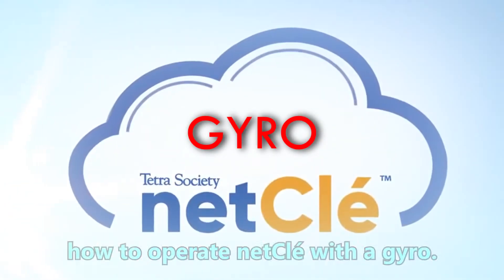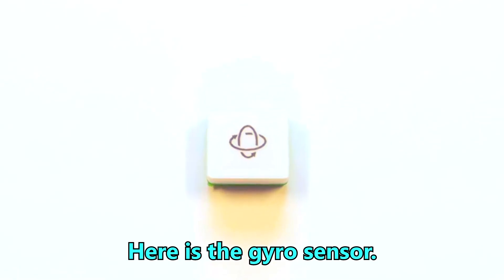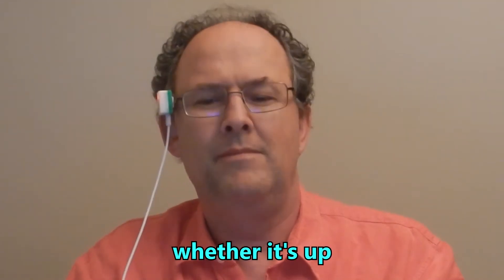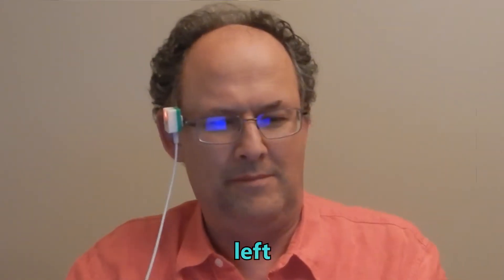This video will demonstrate how to operate netClé with a gyro. Here is the gyro sensor. It is worn on the side of your head and senses which direction your head moves, whether it's up, down, left, or right.